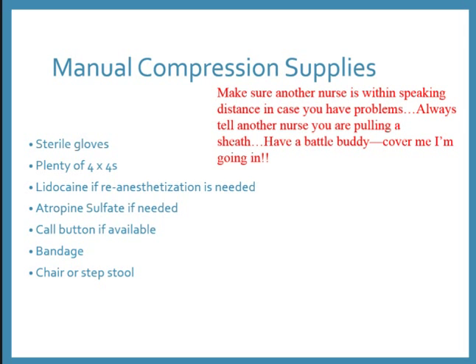So, manual compression supplies. Before you go in the room, you should gather your supplies. The first thing I like to do: the policy suggests that you have 2 nurses in the room.